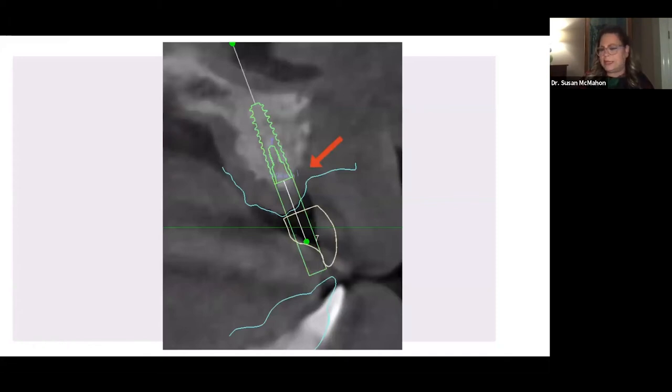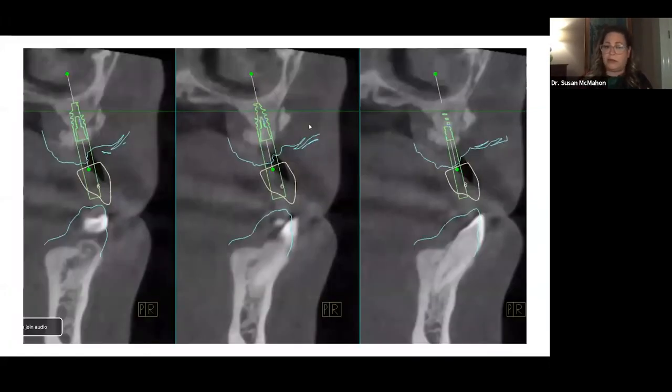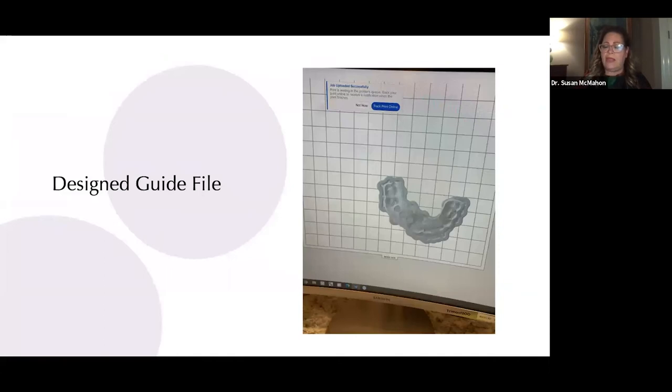I know in this case, he needs a little bit of a bone graft on the facial of this implant. You can see it there. So we know when we put him in, we're going to graft a little bit there. And then 360 imaging makes me a design file. They make me a guide file. So we've planned the whole guide and it comes to me via email very quickly and then I can print it. So this is all happening at one time.